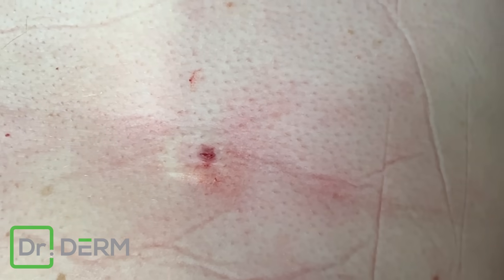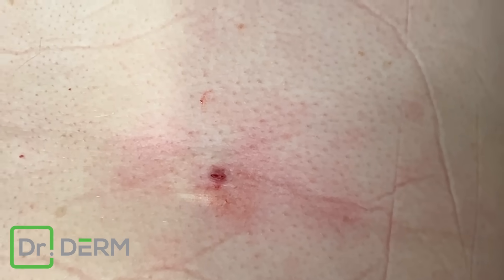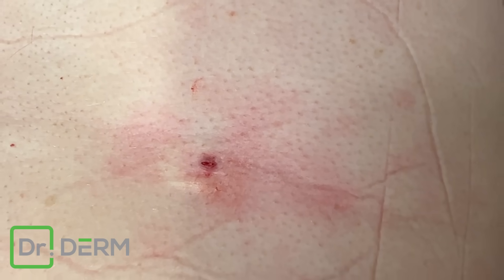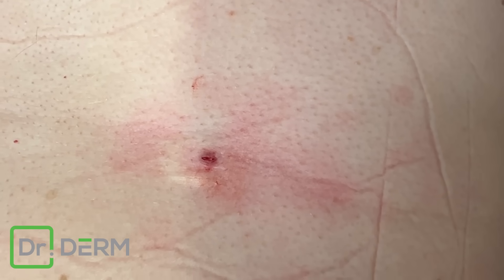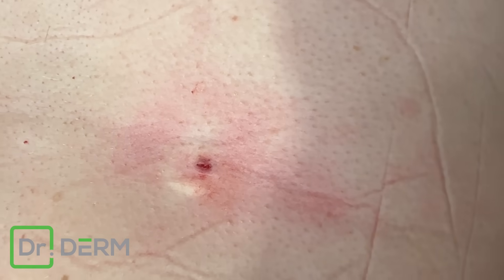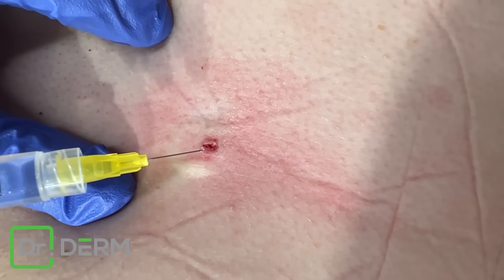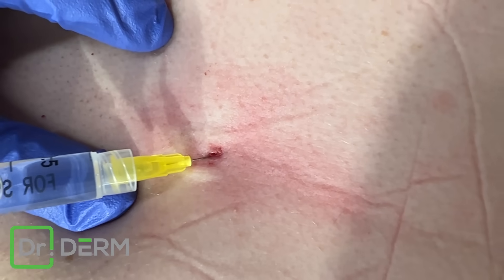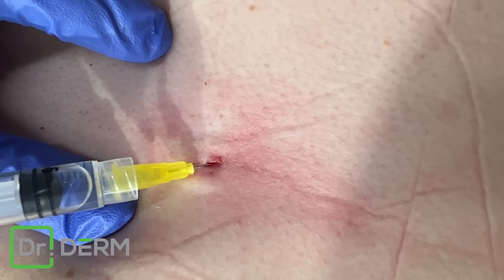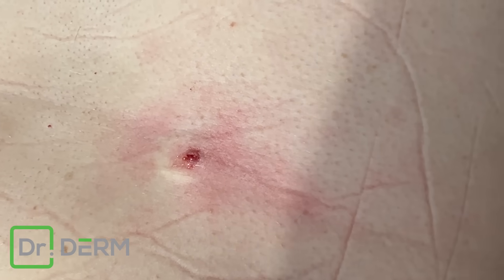The last thing — again, I'm using a super fine electric cautery. Should we numb it a little bit like the other one as well? Kind of similar, yeah. Thank you. Just in case — the last part I kind of felt. So I really like to use a little electric cautery to keep this from coming back. Now that we got the cyst out, I'm going to clean it and put a little tiny bit of numbing. Can you feel that? That's the numbing, sorry about that. So there's a little buffered lidocaine — we like to buffer it because lidocaine on its own is really acidic, so it can sting a bit when you use it.